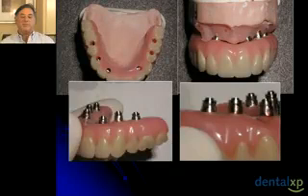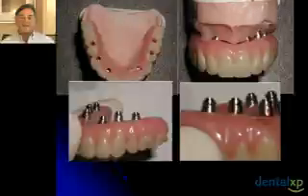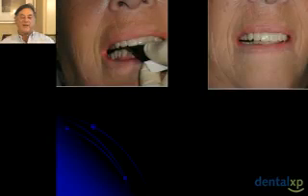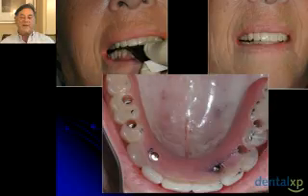My teammate sits down. There's special abutments that are used for this particular process. This is a final restoration with a titanium frame and acrylic teeth and acrylic gingiva milled onto that or attached to that. Patient is inserted, occlusal marks. These are the very, very first occlusal marks as the case is seated.